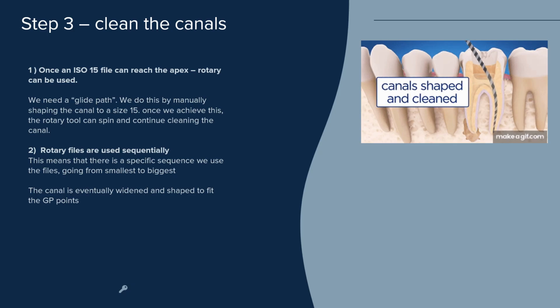Okay, step 3 is to clean the canals. So once a 15 file can be used to the apex, rotary files can then be used. Dentists need what we call a glide path. So we need to make sure when we're going to use these rotary files that it just glides in. Okay, so we use a very fine tool first, a 15, to make sure we can get good access all the way there. And then these just glide in there.